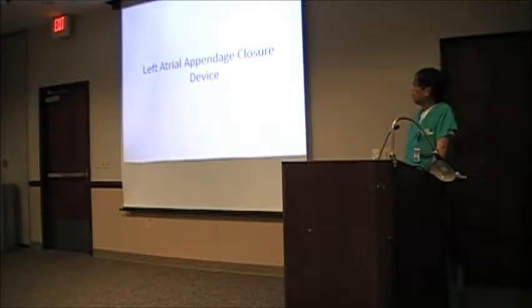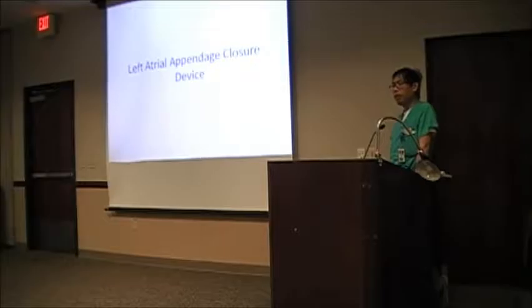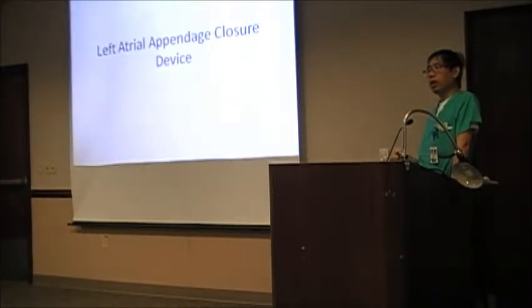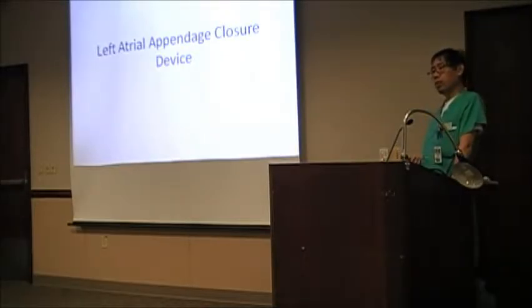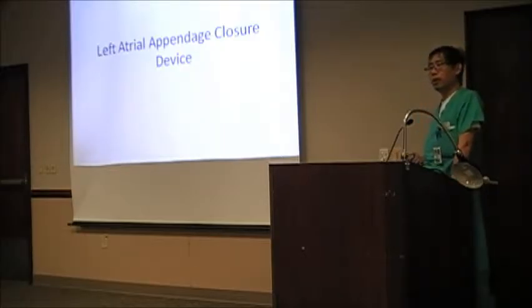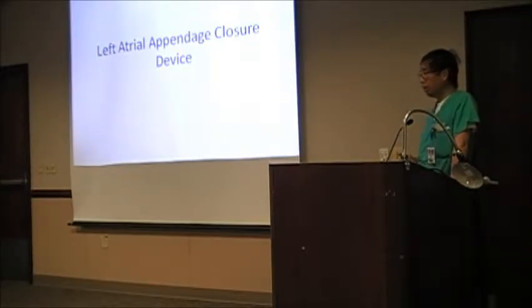And we talk about the left atrial appendage. This is a very, very new topic area. In the last 2 to 3 years, it's been a very hot topic in the EP field for managing atrial fibrillation. The majority of the procedures and devices we're talking about today are still investigational. They're not FDA approved, so sometimes some centers try to use them off label. And we use something, you will see on the slide today, the only FDA-approved device, called Watchman. So I'm probably more focused on Watchman today, but we haven't started it yet because the reimbursement, indication, and patient selection are sometimes more complex than in the articles.